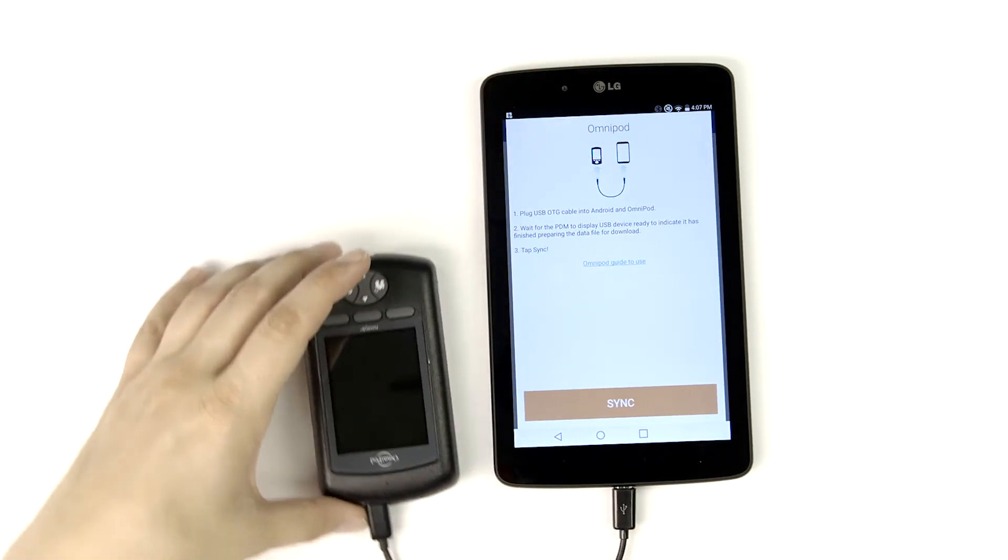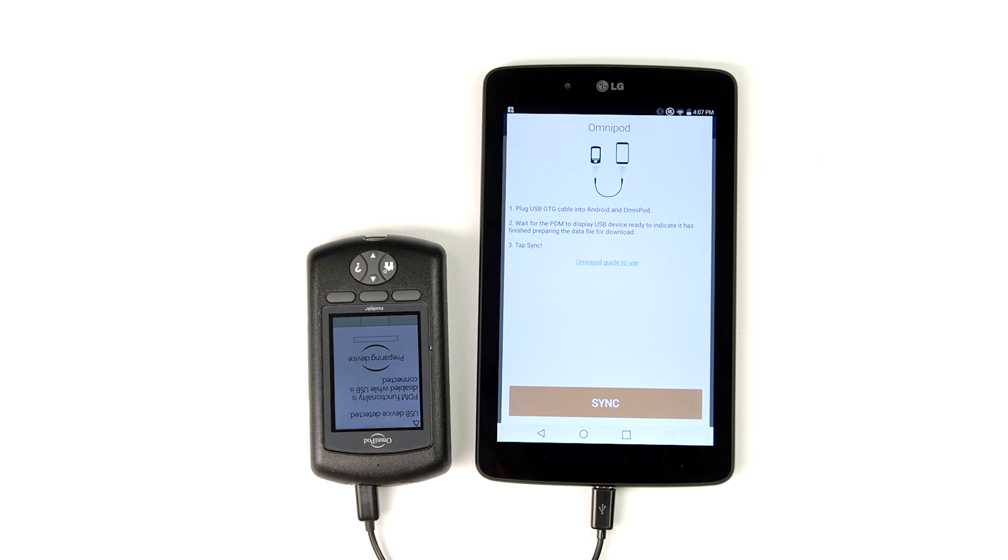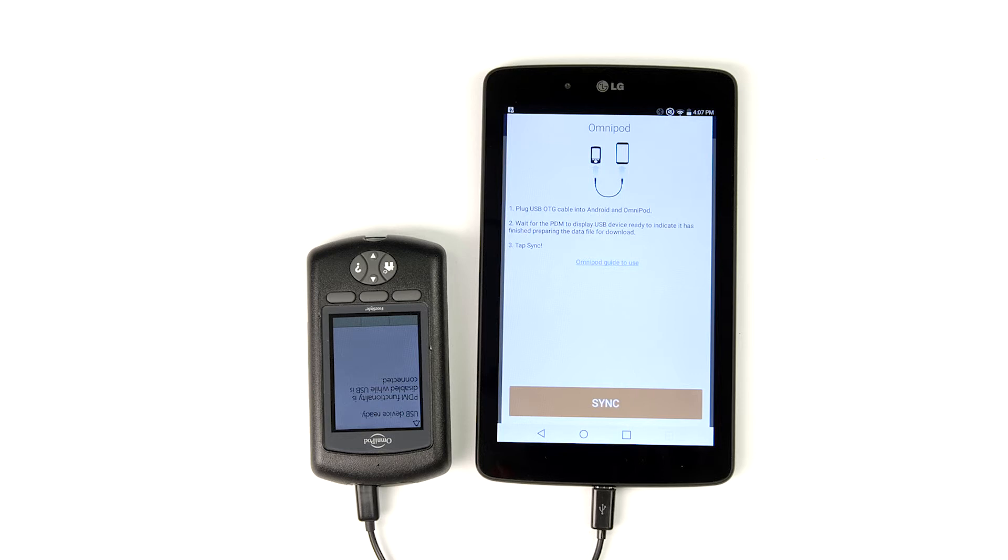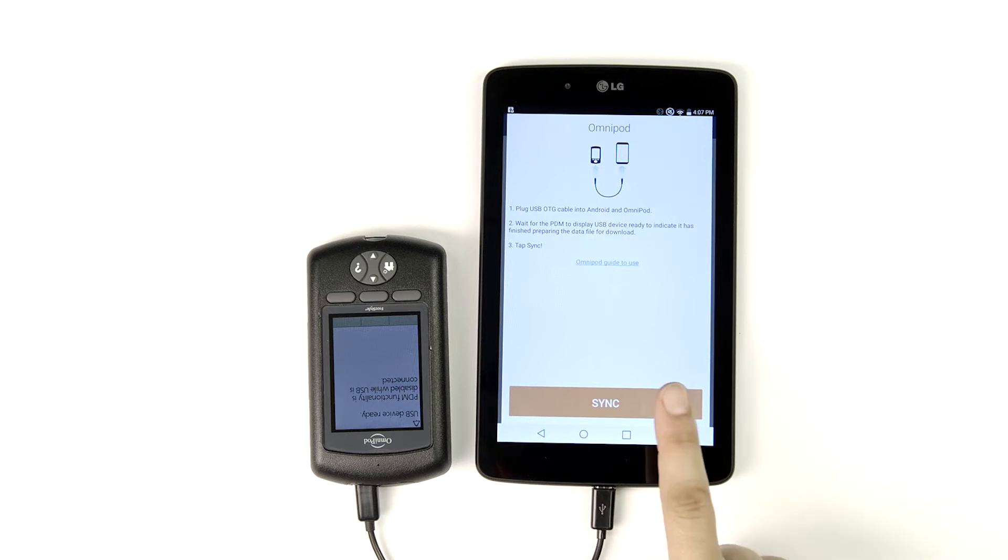You'll hear one beep, followed by two groups of four beeps. These tell us the PDM is ready to transfer. Tap Sync.